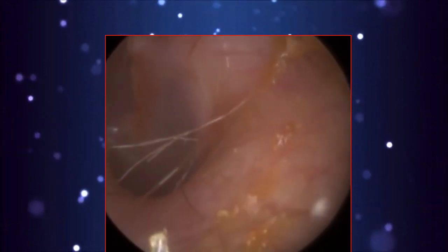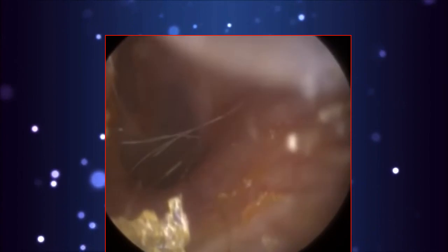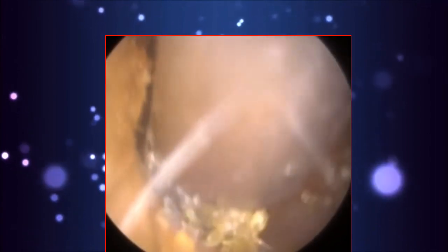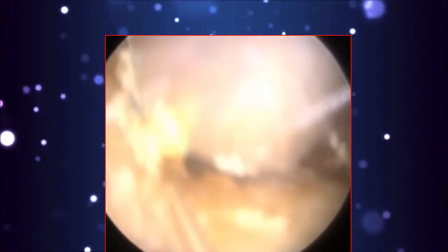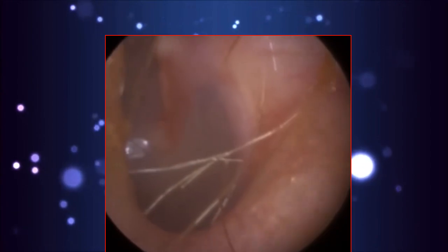I thought I had enough space to gently remove it, and these you can see there's hairs there, and these forceps that I use, they are micro forceps. They're the smallest ones. You get different sizes, and these are the micro ones now, with a fine jaw as well. On camera, you might think, "Oh, that looks really big," but remember, guys, this is magnified considerably. But they are the most minute of forceps we use.